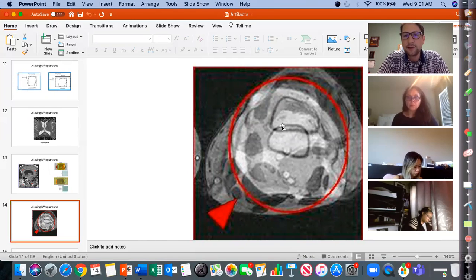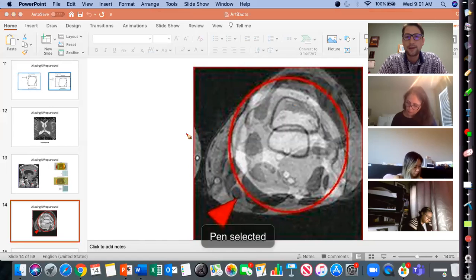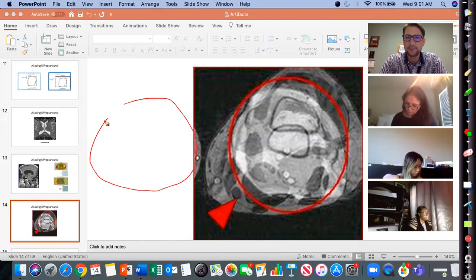It's tough to tell. But remember, with the femur, we typically lay that abdomen coil on top of both legs, right? So what's happening is this leg also has signal coming from it. And this leg typically looks just like the other leg, and it's getting mismapped into our field of view.